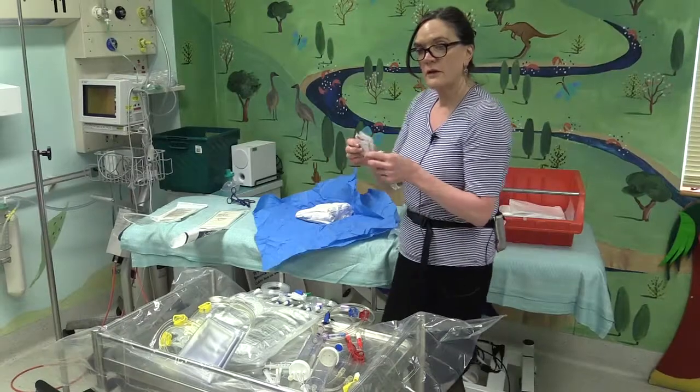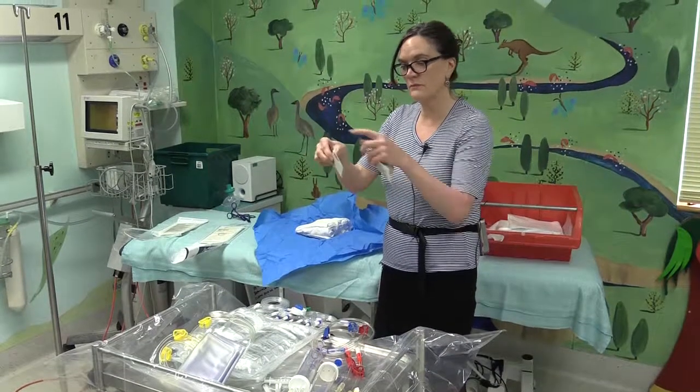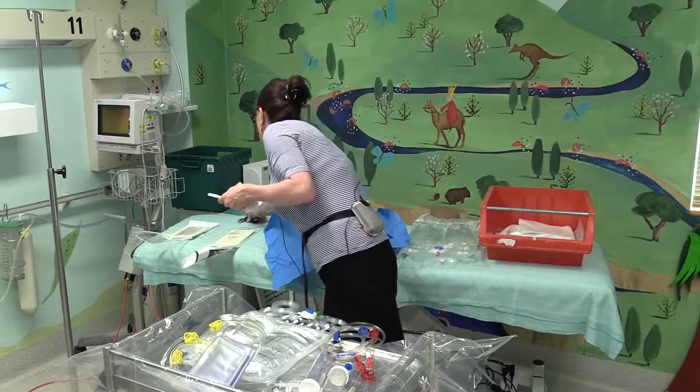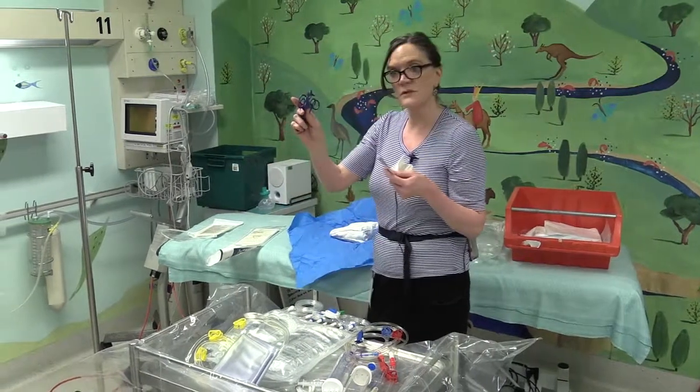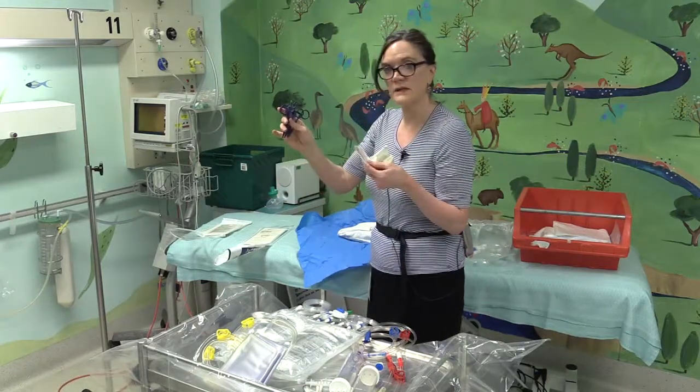I have 2 alcohol wipes, which I'll get my assistant to peel open, and I'll take them once I'm scrubbed. And I also have some clean clamps, which I'll need at a later stage. They've been cleaned with antiseptic as well.